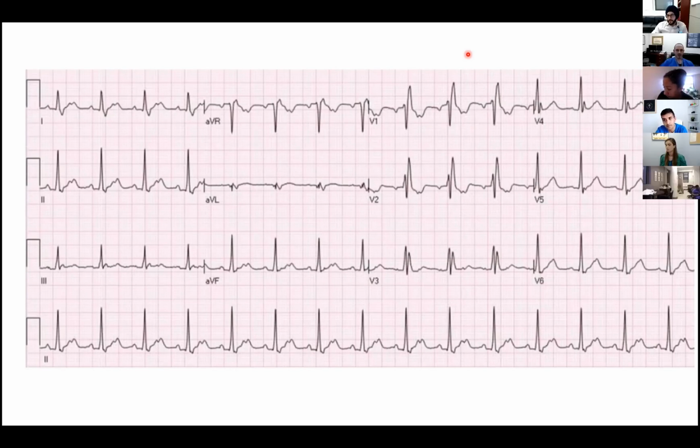You immediately came to a certain differential. So now you have a regular arrhythmia, narrow complex. There are more P waves than QRS complexes. So what's your differential? It could be either atrial flutter, or there's I think one more. I have to look at the chart. Yeah, just look, and I'll tell you, it's focal atrial tachycardia. So those two are the only possibilities.